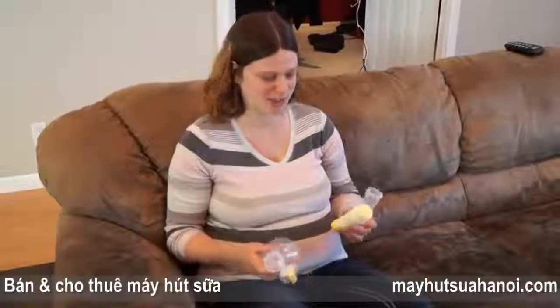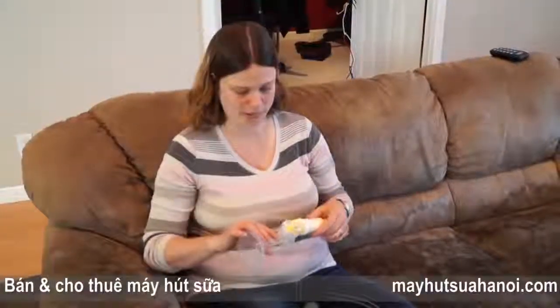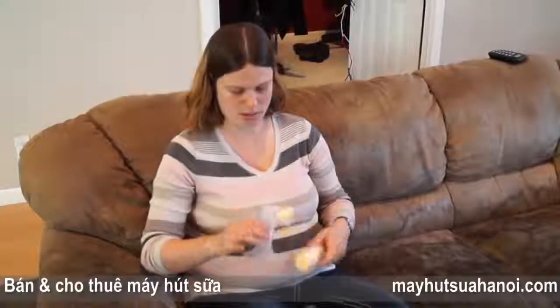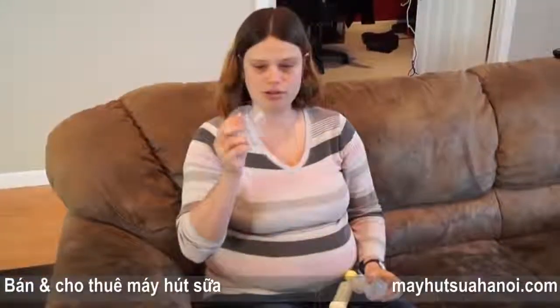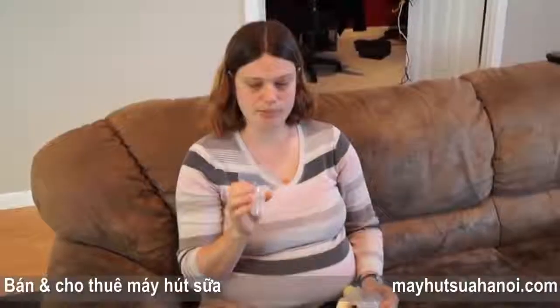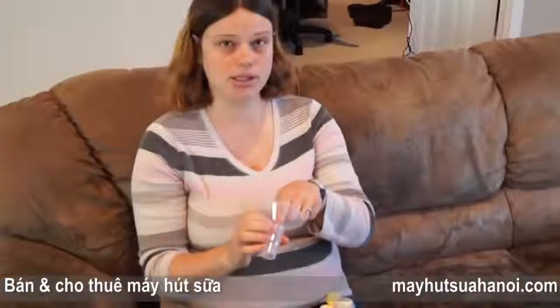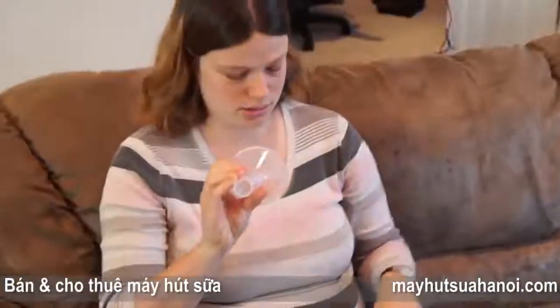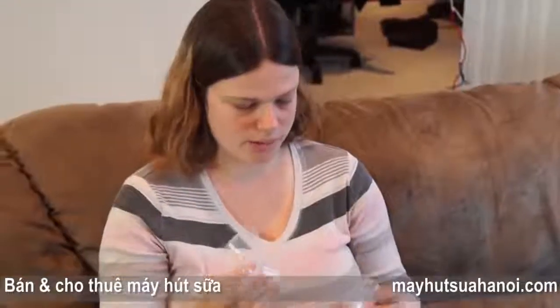Babies. Today I'm going to demonstrate a manual pump. This is a Medela pump, which they actually gave me in the hospital. And there's basically three parts. This is the horn, or the flange, and you want to make sure the flange on your pump is big enough that when you put your nipple in, the nipple does not touch the sides. So mine are fairly big. This is the 27 millimeter flange.